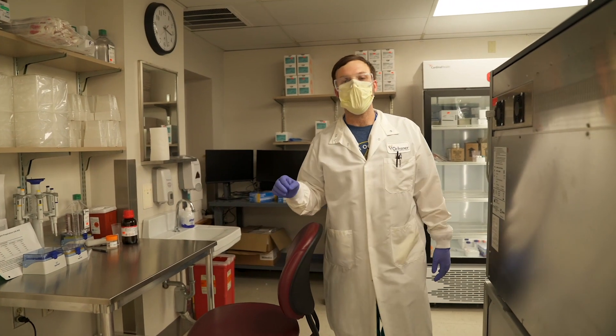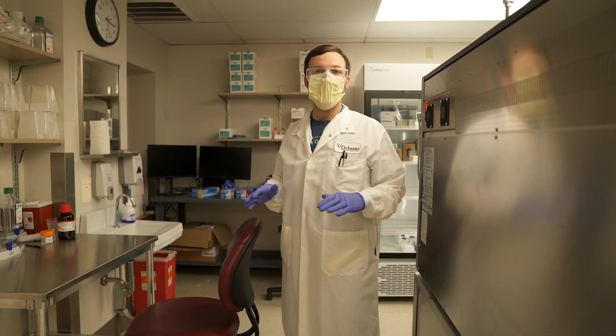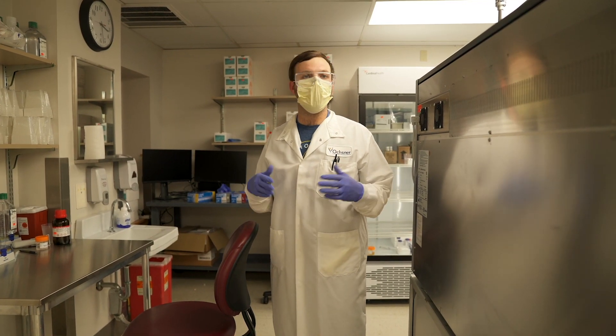Every area is dedicated and has dedicated equipment to ensure that we don't have any type of cross-contamination, whether it be from samples, reagent, or personnel.